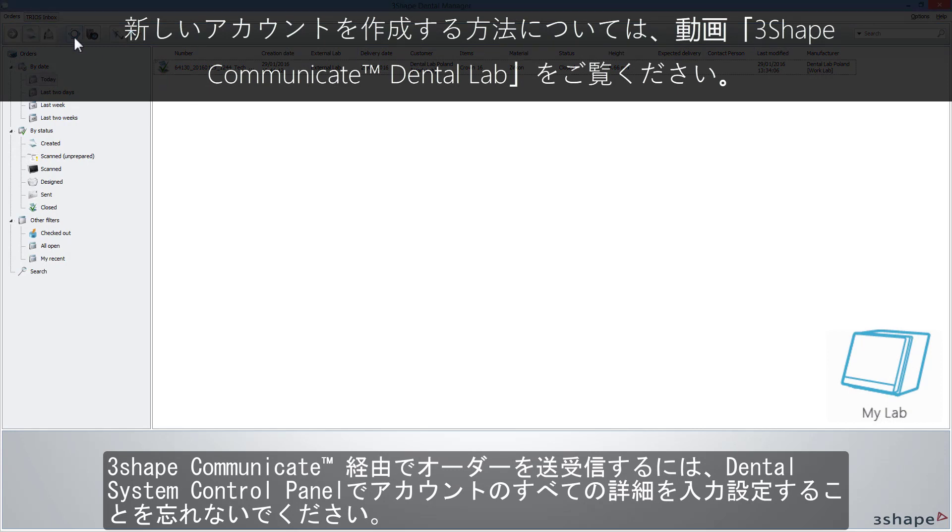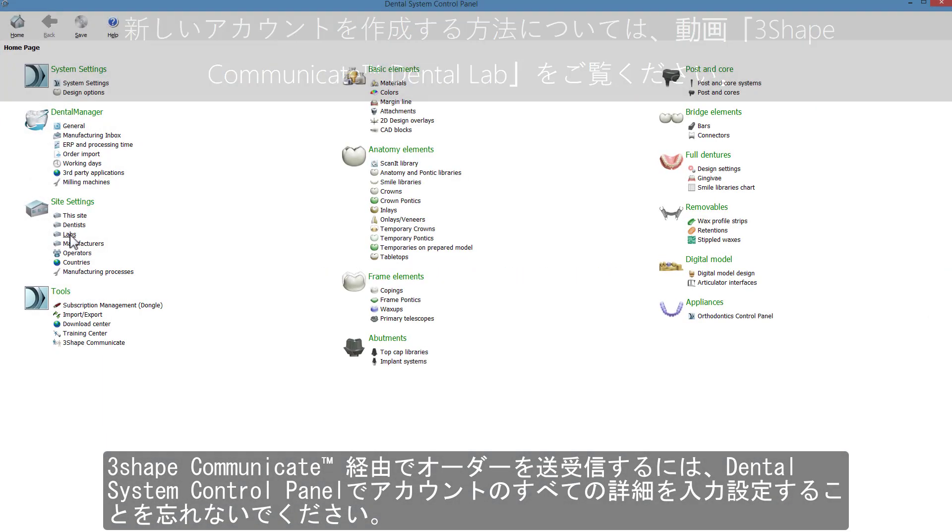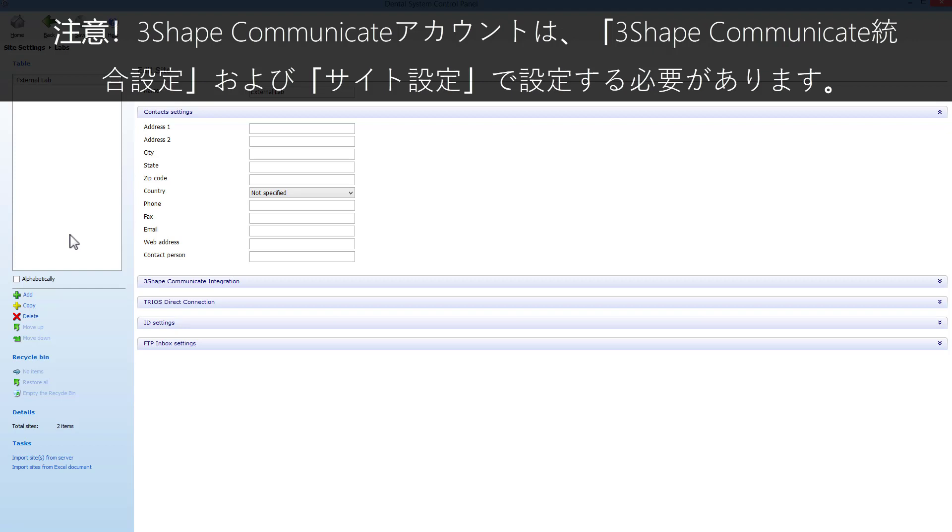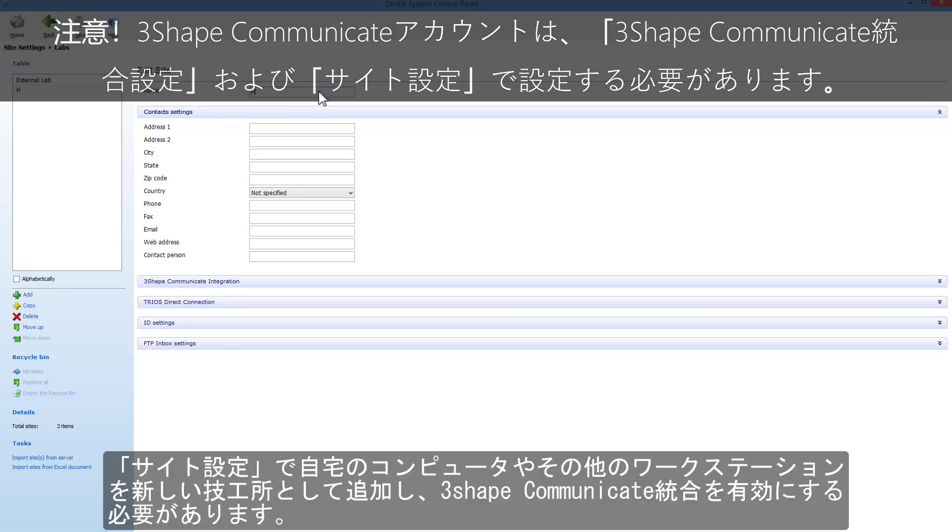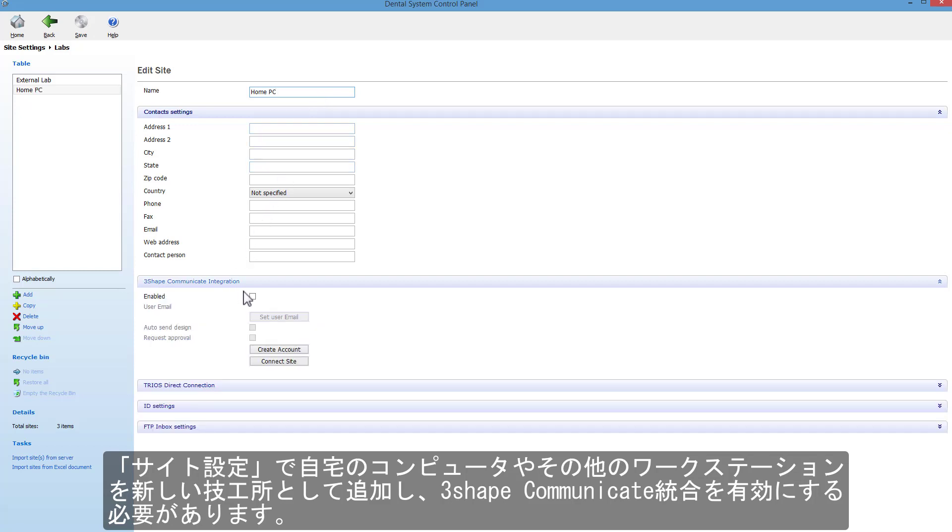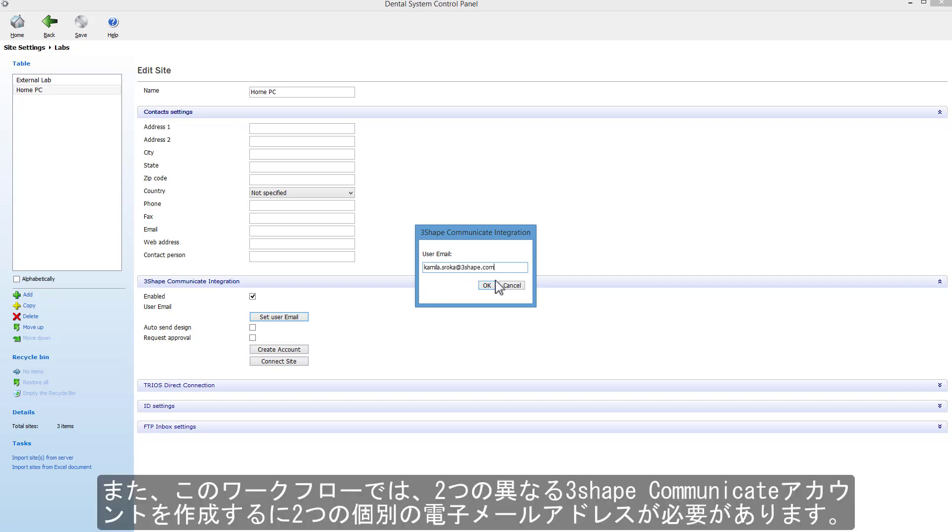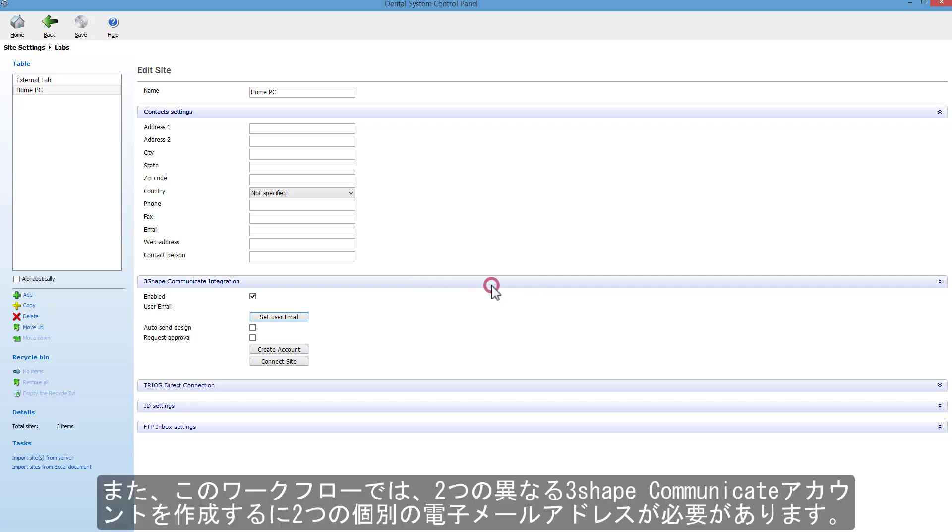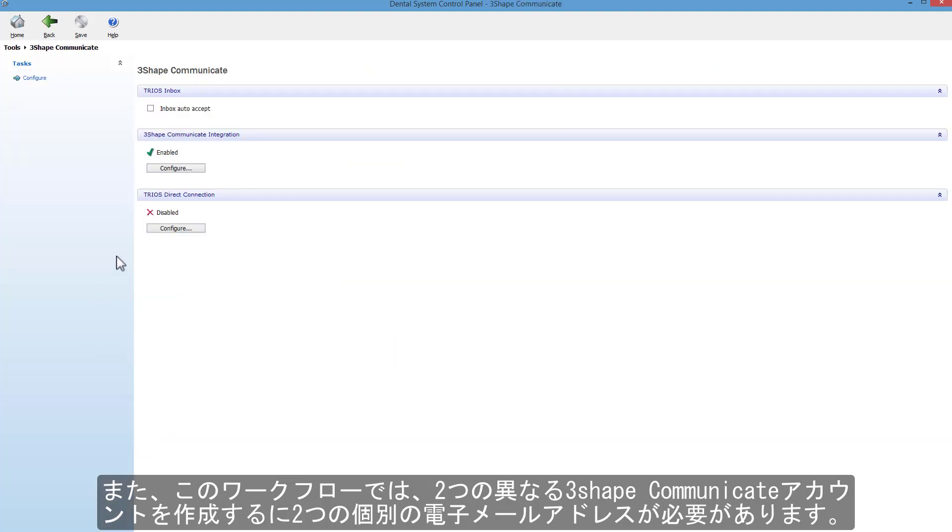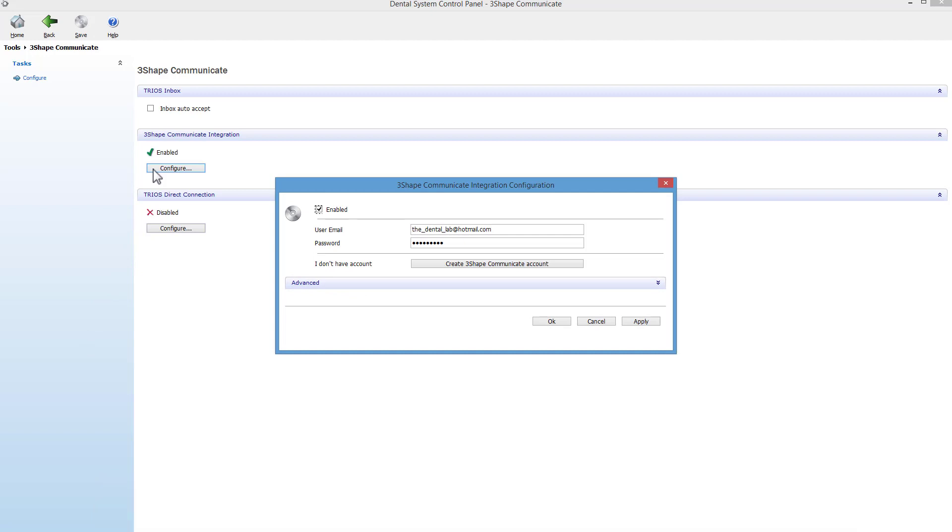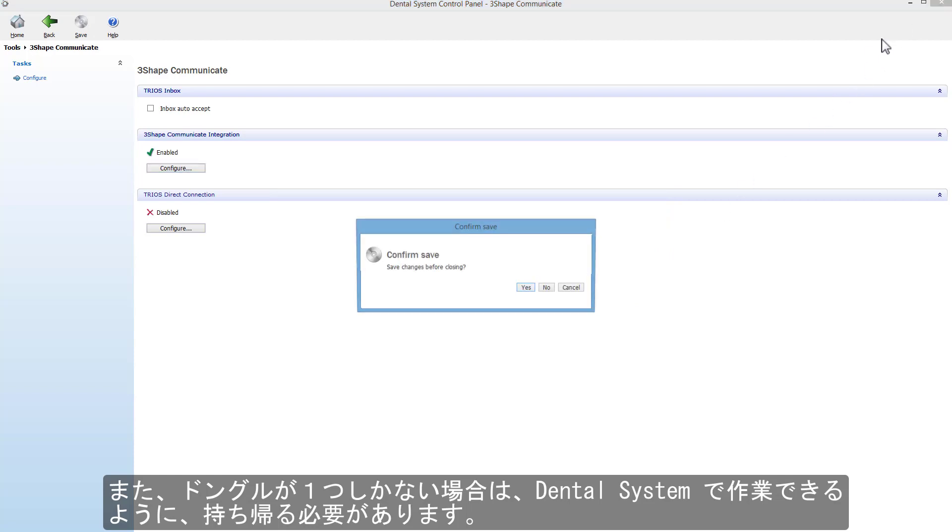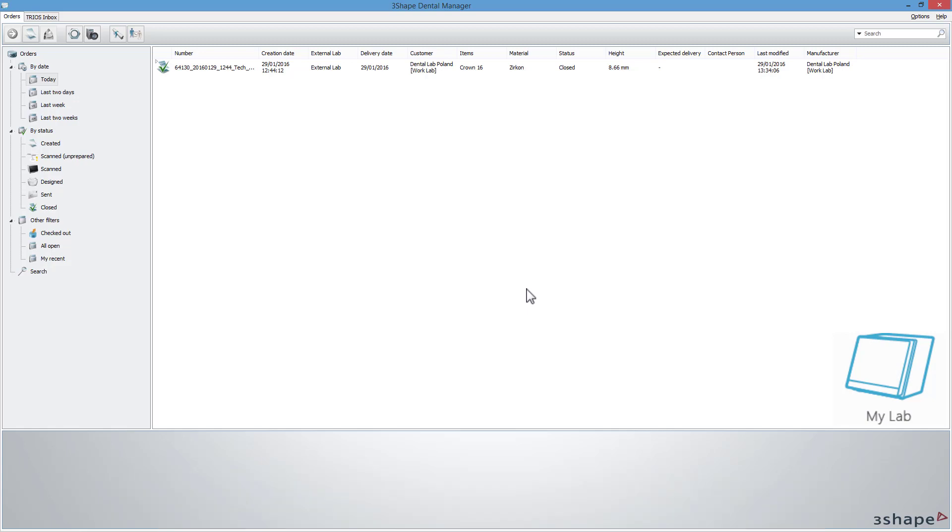To send and receive orders through 3Shape Communicate, remember to set all the details for your account in the dental system control panel. Remember to add your home PC or other workplace as a new lab in the site settings and enable the 3Shape Communicate integration. Also notice that with that workflow you have to have two separate email addresses, and you need to create two different 3Shape Communicate accounts. Also keep in mind that if you have only one dongle, you need to take it home with you to be able to work with the dental system.